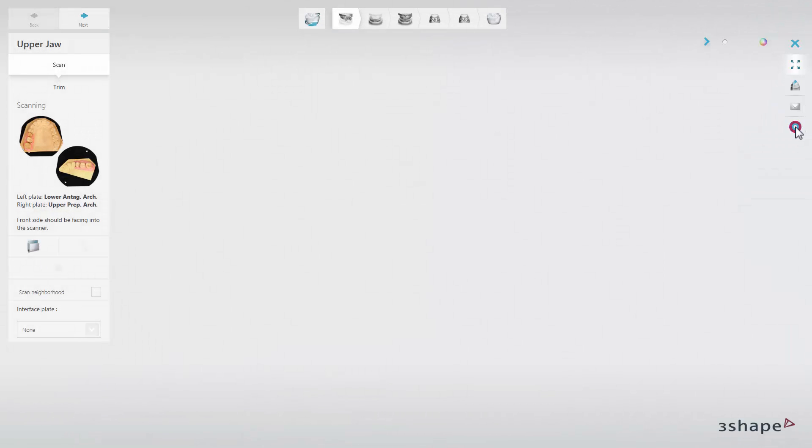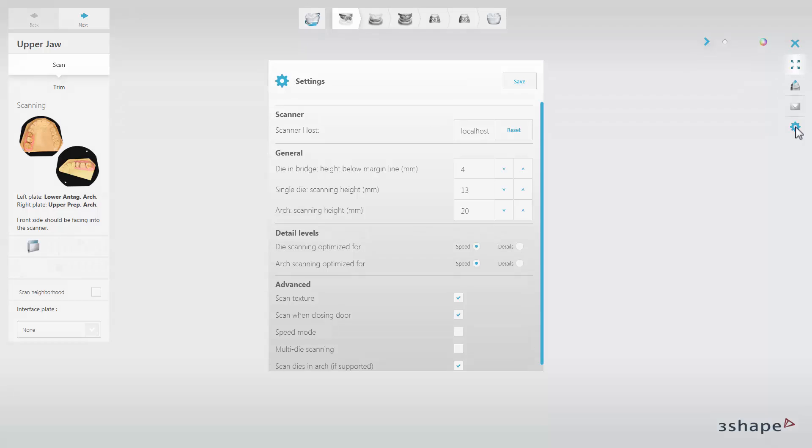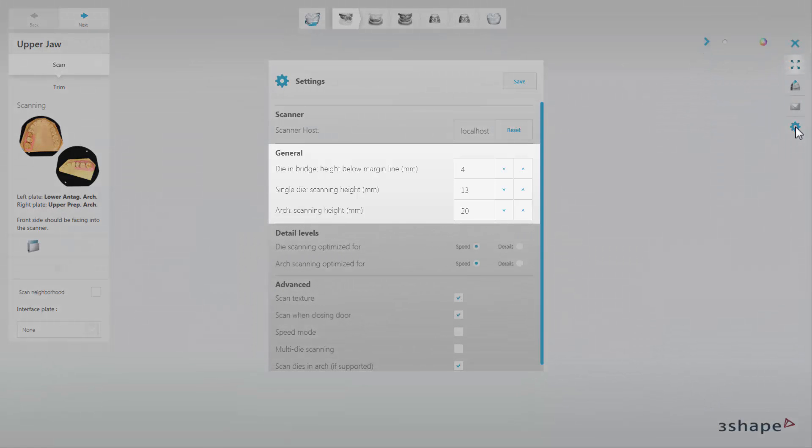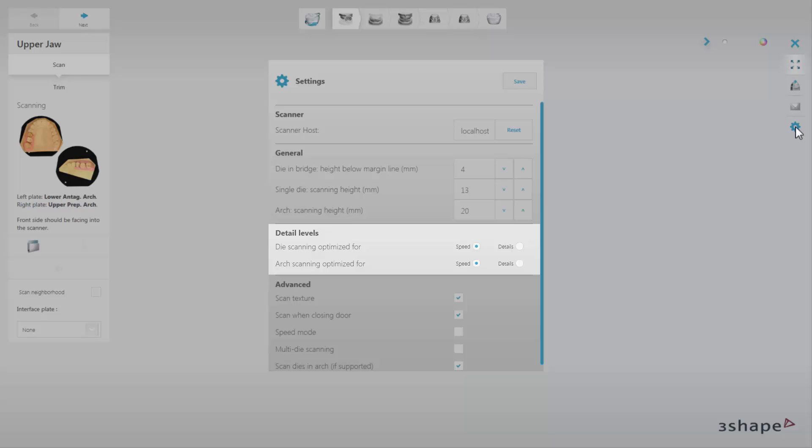In Settings, the General options allow you to set the individual scan height, whereas the Detail Levels option allows you to set up speed scanning or detailed scanning.